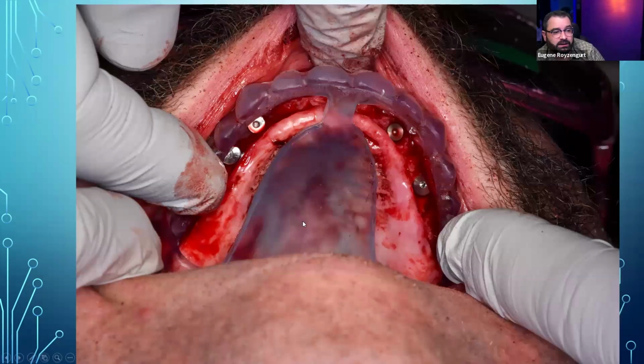And the other one, here's the trough that tells the doctor within this parameter, this is the best area to place the implants for this type of prosthesis. So basically what the dentists usually do is, let's say the patient already has a denture, which was the case with this patient. They'll put fiduciary markers on there. They'll do a scan, and you can see where the teeth will line up with the patient's ridge, okay?